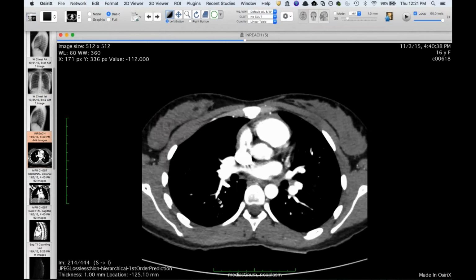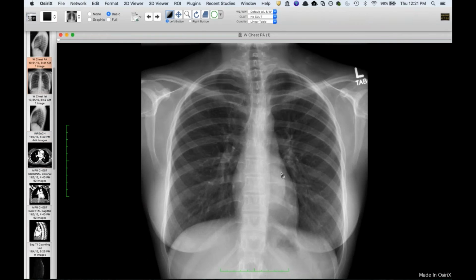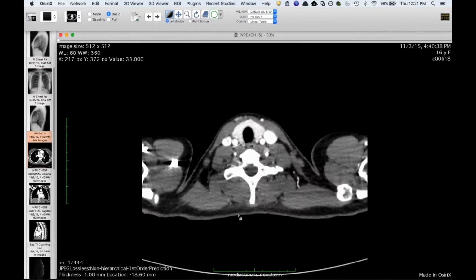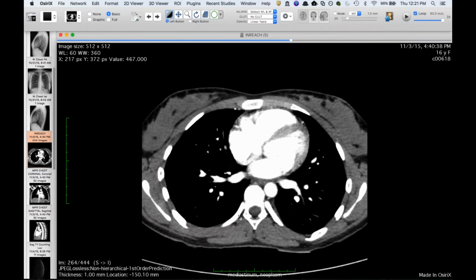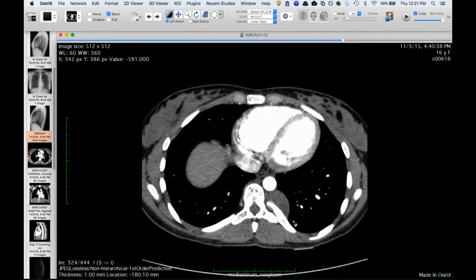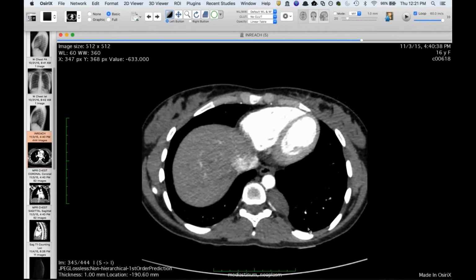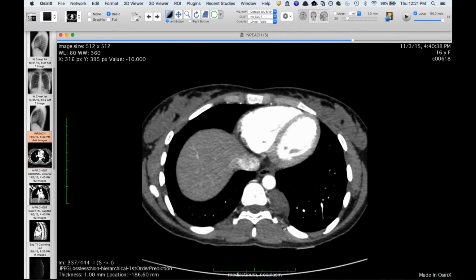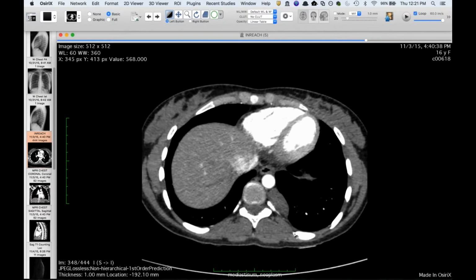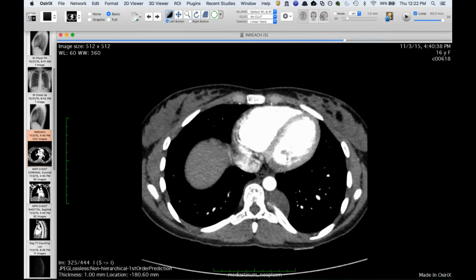It's got an incomplete border sign consistent with an extrapleural lesion, right? Right, yep. It's either extrapleural or broad-based abutting the pleura. And here you can see it's a unilateral posterior mediastinal mass, and I'll show this one just because it's a very typical look for this in a young patient. You can see it's fairly uniform in its low attenuation, but it's not uniform fluid attenuation.